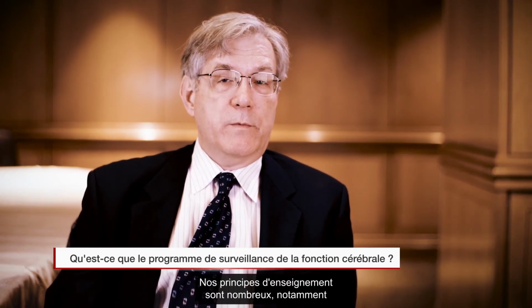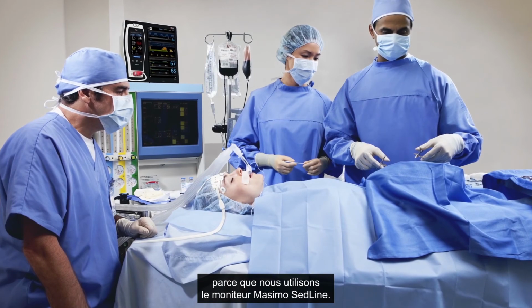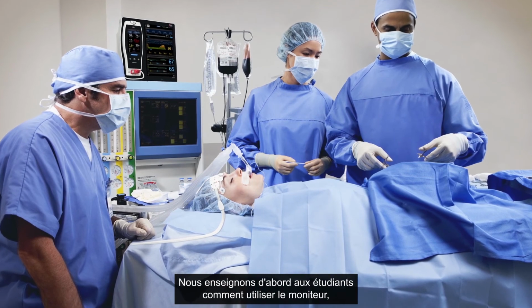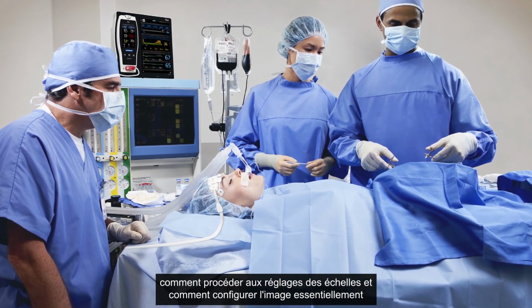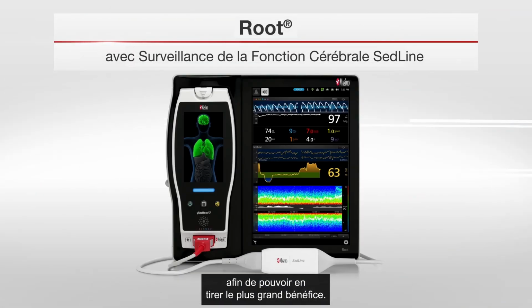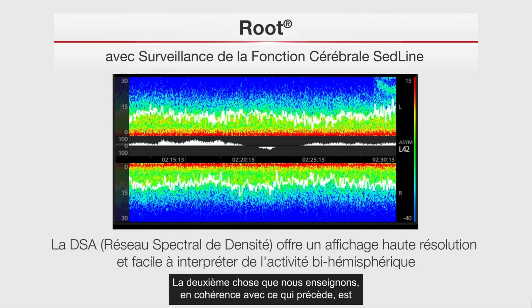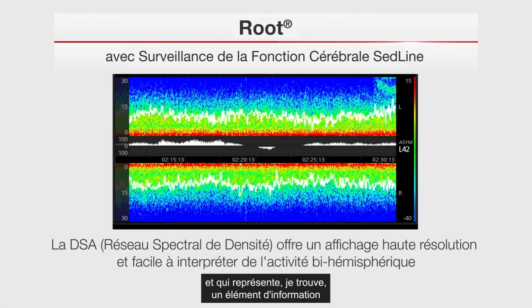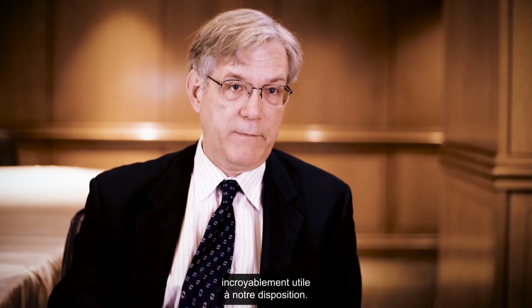The teaching principles that we work with are several. One is, because we're using the Masimo SedLine monitor, we first teach the learners how to use the monitor, how to make adjustments to the scales, and how to set up the picture basically so that they can get the most benefit from it. The second thing that, in concert with that, we teach is how to use the density spectral array, which is part of the SedLine monitor, and I find to be an incredibly useful piece of the information that we have available to us.